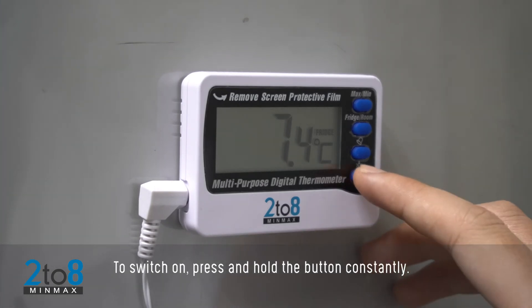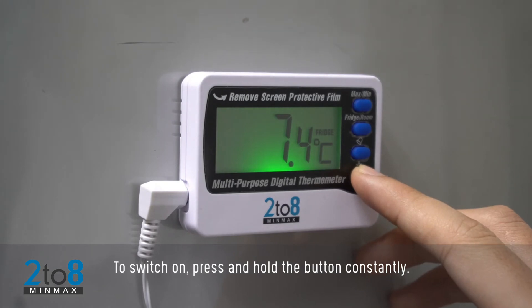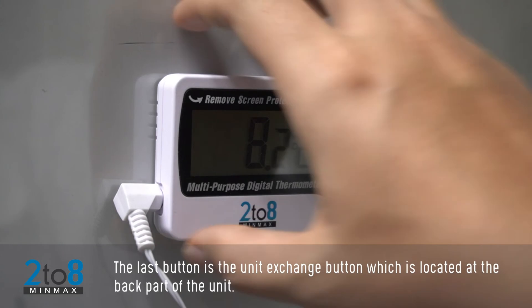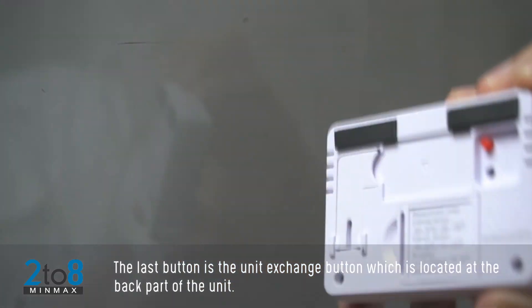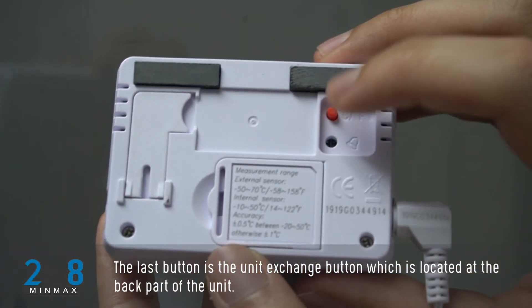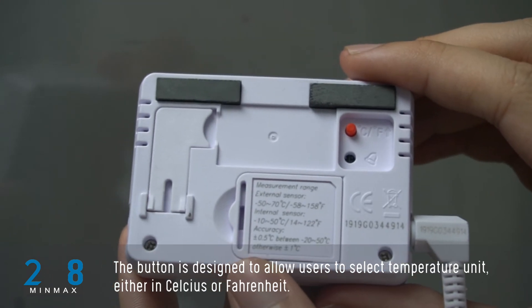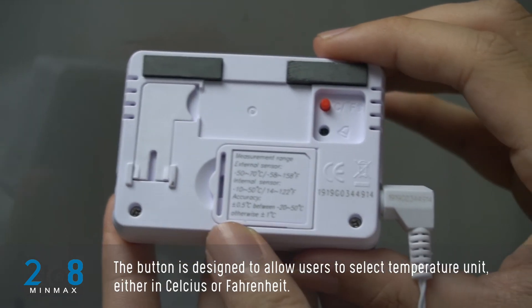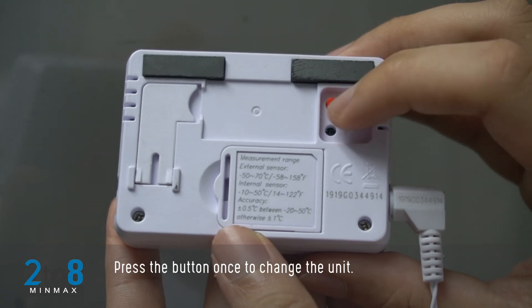To switch on the backlight, press and hold the button constantly. The last button is the Unit Exchange button, located at the back of the unit. It allows users to select the temperature unit in either degrees Celsius or degrees Fahrenheit. Press the button once to change the unit.